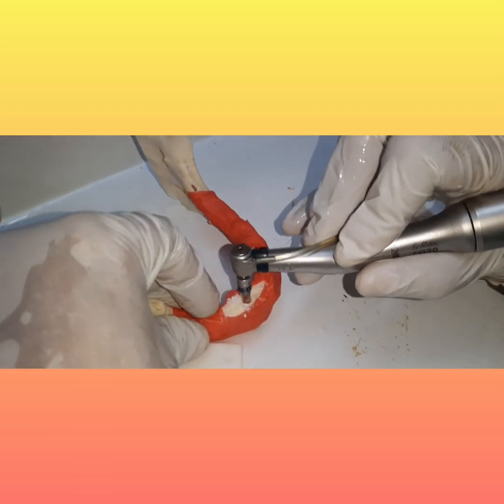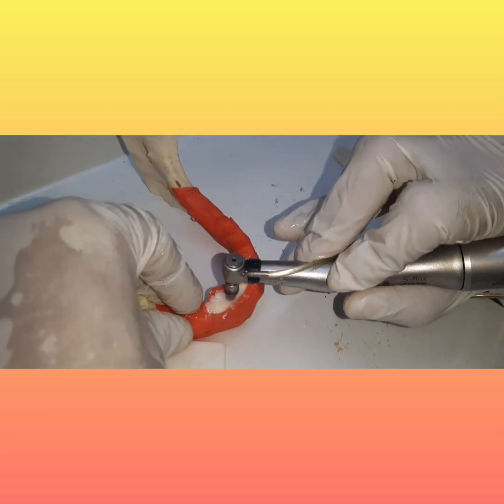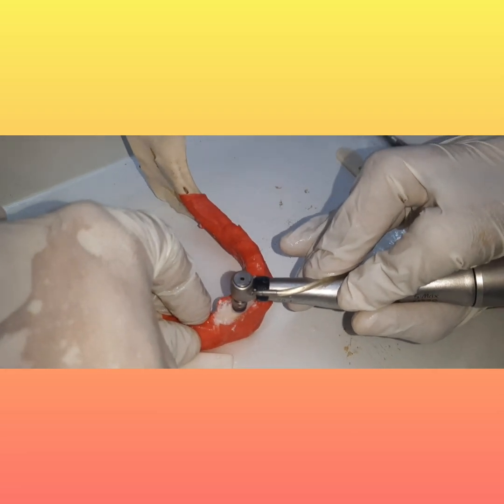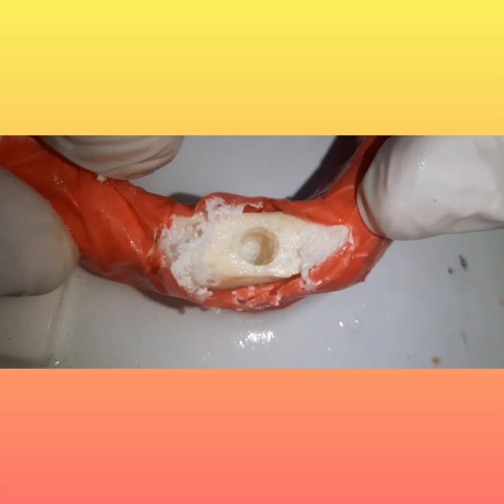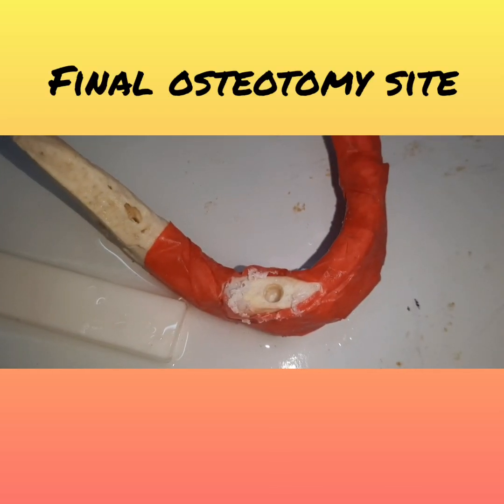Lock it into position and again go to the osteotomy site and go very slowly till the stopper and stop. So this is the proper osteotomy site which you can see, and it is prepared till a final diameter. So this is the final osteotomy site, prepared till the final diameter, and the next step would be to place the implant.